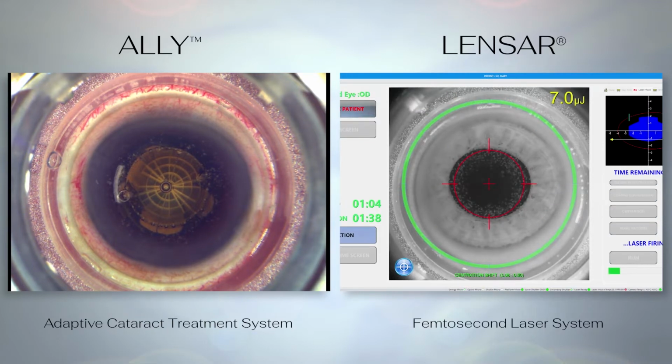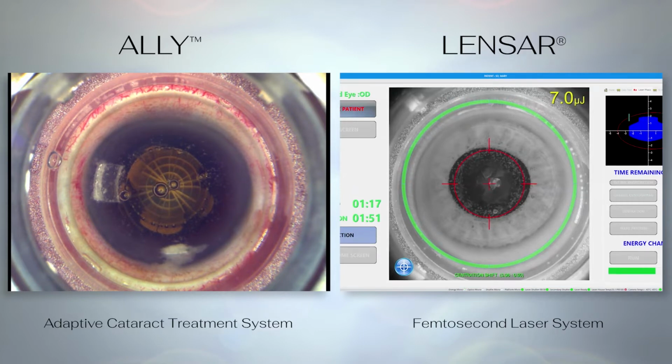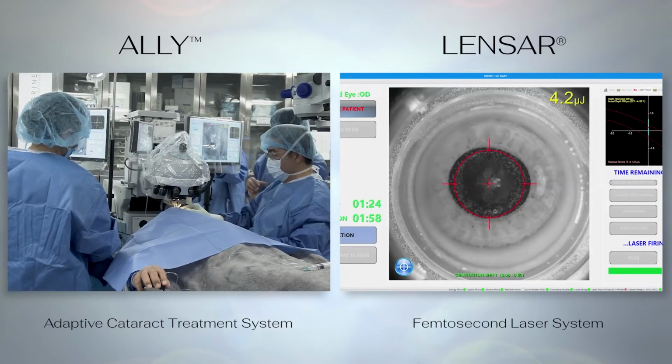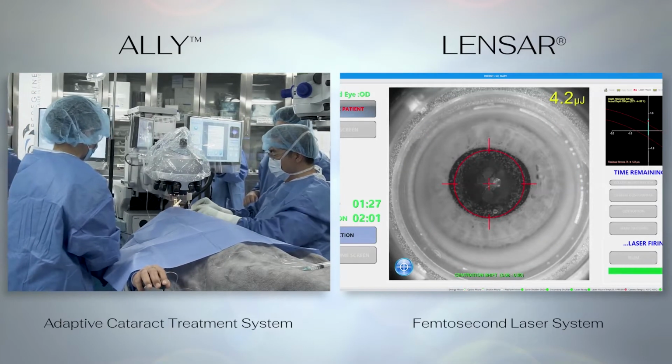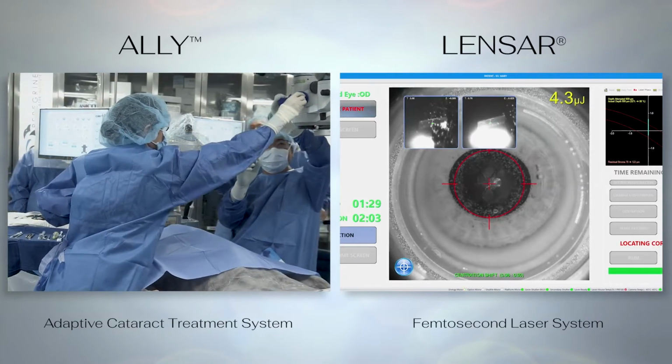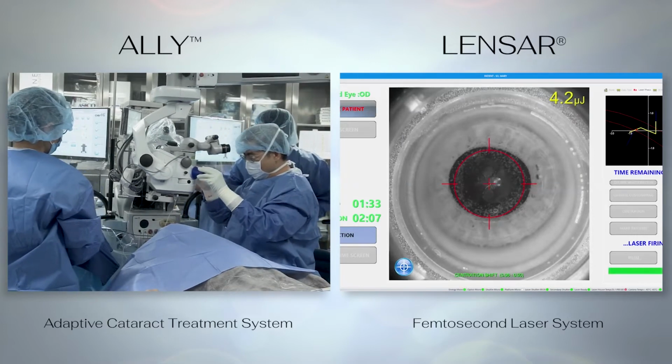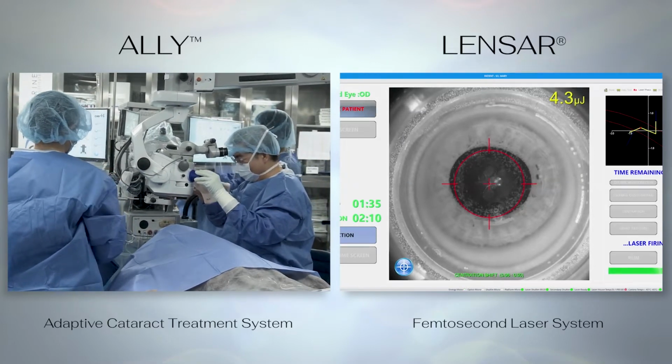And you can see here the quick creation of the clear corneal incision, the main incision. We just do it in a single pass, followed by the paracentesis incision, also done in a single pass. And before you know it, the laser portion is over. And this is maybe the biggest shock: after you've done the laser portion, you're waiting for the nurses and staff to move the patient to the phaco machine, but then you realize you're on deck. You have to do the next step.